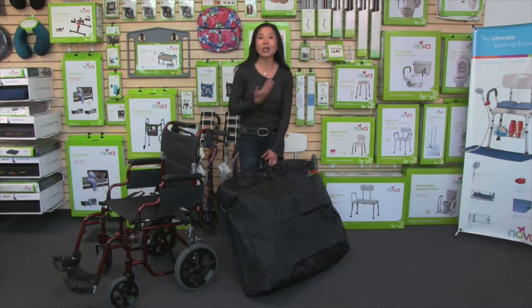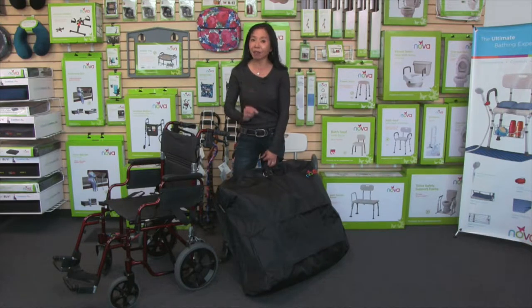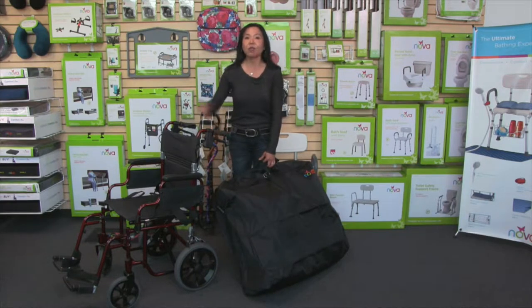This travel bag fits all of Nova's rolling walkers, with the exception of the Mighty Mac heavy-duty, and it will also fit most brands of rolling walkers. It will also work for transport chairs with a fold-down back, but it will not work for a wheelchair with a large 24-inch rear wheel.